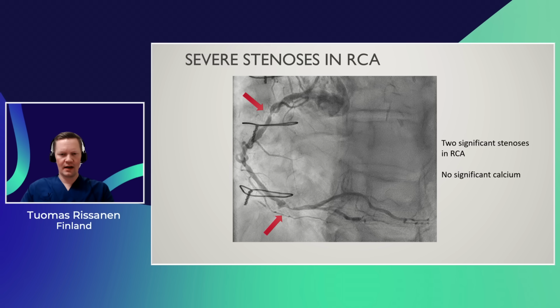And if you look more carefully, you can see that there is no significant calcium, at least angiographically, and there is also some size variation, especially in the more distal lesion. I think this is also an important consideration regarding DCB or DES strategies.